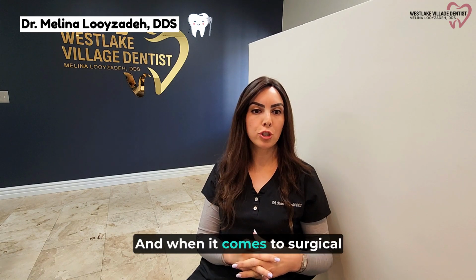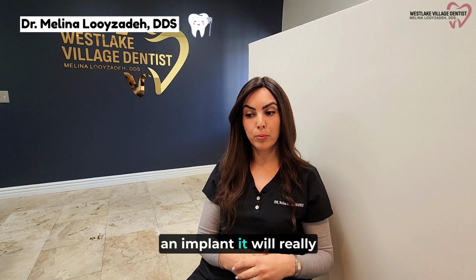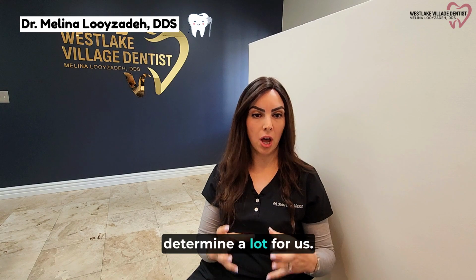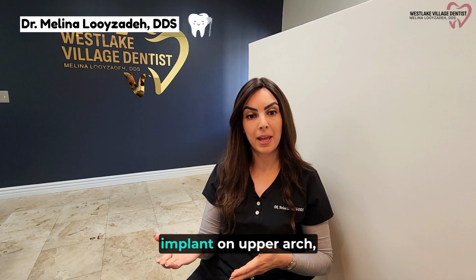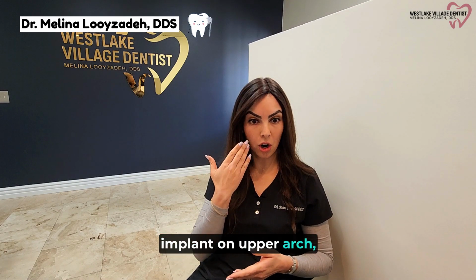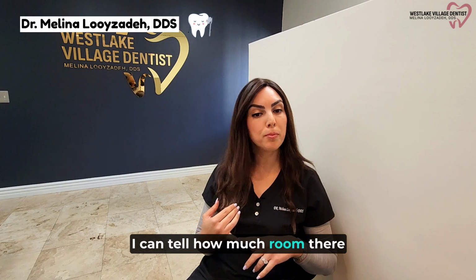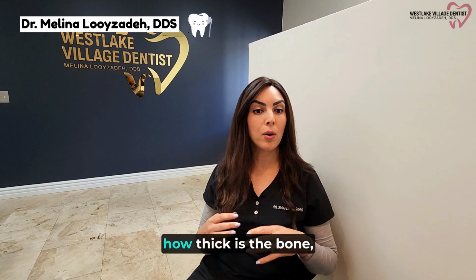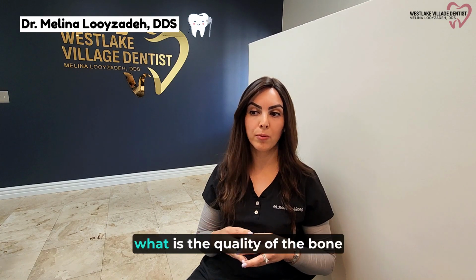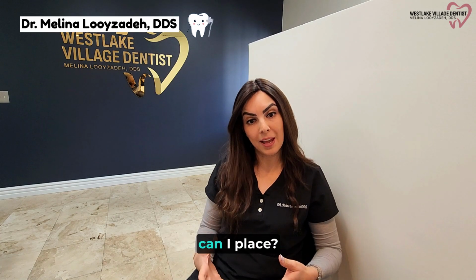And when it comes to surgical procedures such as placing an implant, it will really determine a lot for us, the landmarks. Let's say we're placing an implant on the upper arch, upper jaw. I can tell how much room there is until we get into the sinus. How thick is the bone? What is the quality of the bone? What kind of implant can I place?